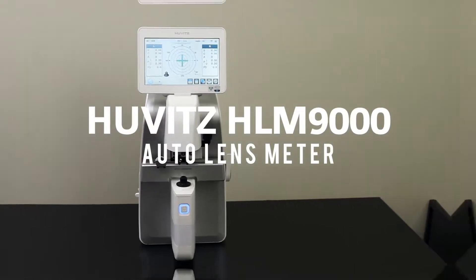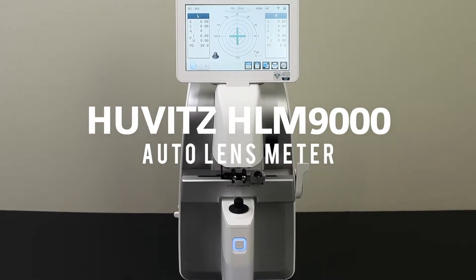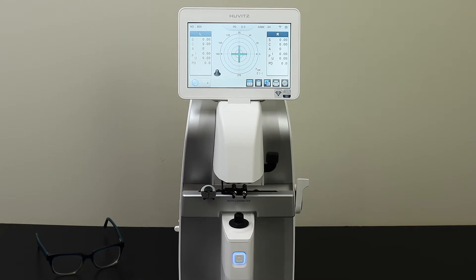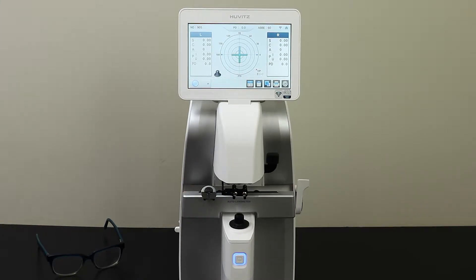The Hoovitz HLM9000 with a 3-year warranty from Norwood Device and Diagnostics. Neutralizing the lenses with the Hoovitz Auto Lens Meter is extremely accurate and easy to do.